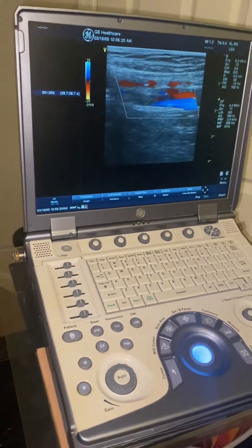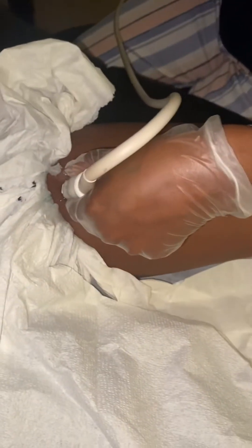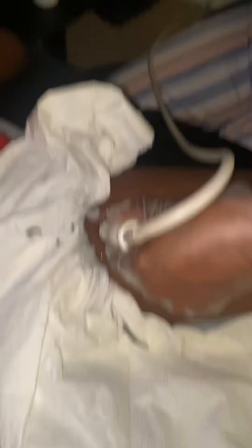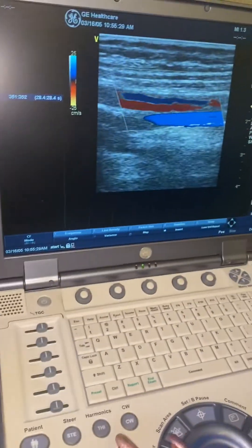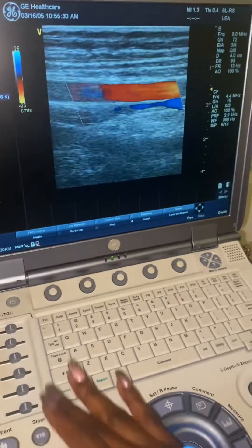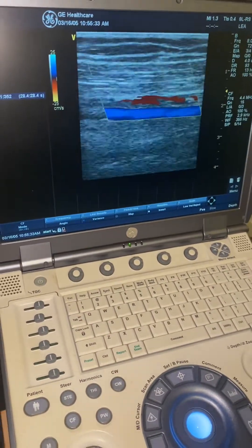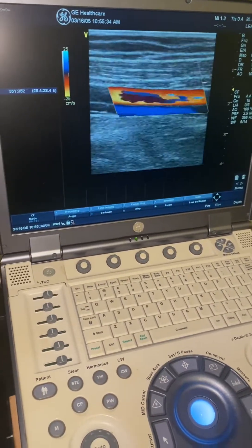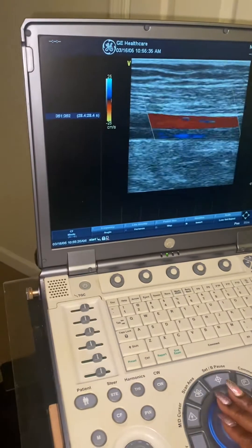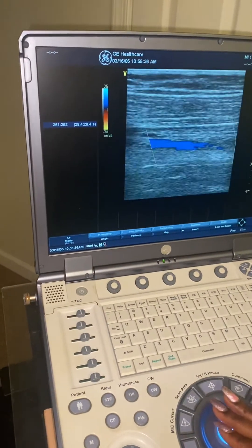You want to stay right at the center. Look at me staying right at the center of the vessel — as I stay at the center, you can see on my screen that I'm able to follow my vessel down. I'm literally just following the vessel down, remaining at the center of the thigh and following the vessel down as I stated earlier.